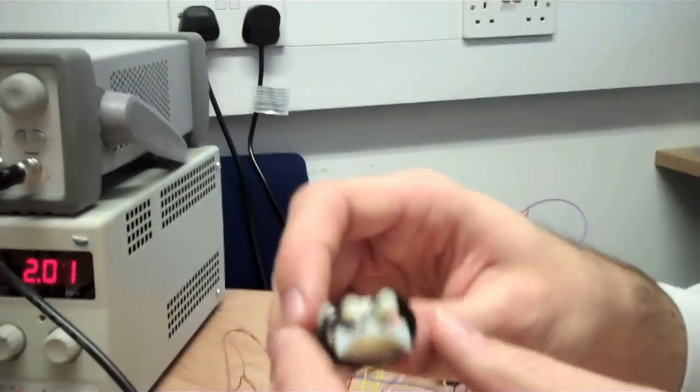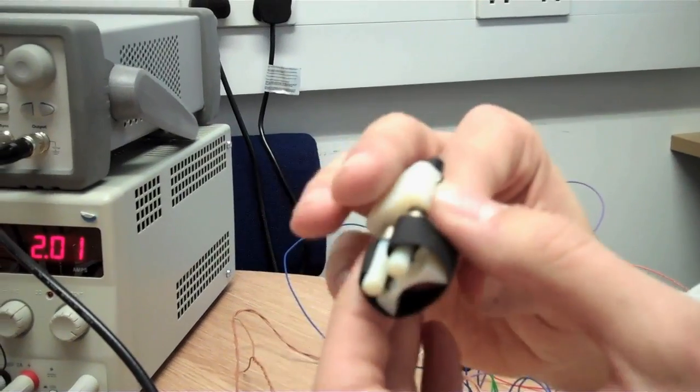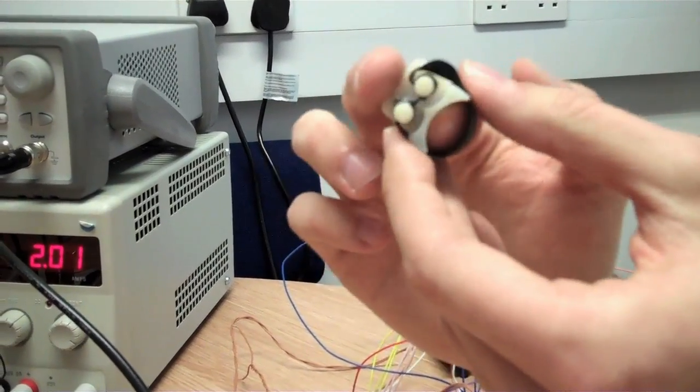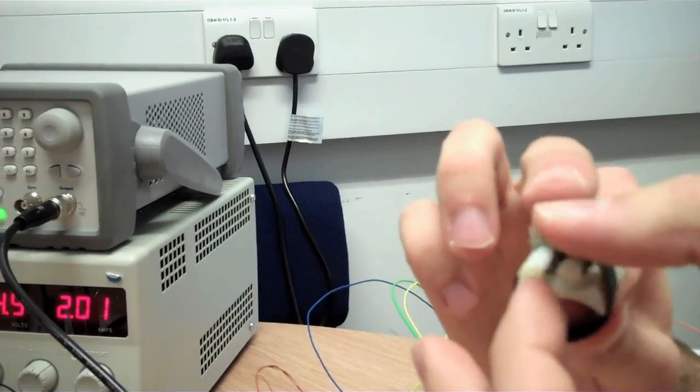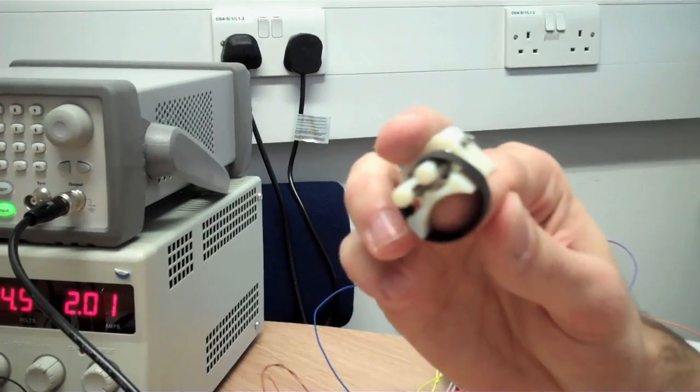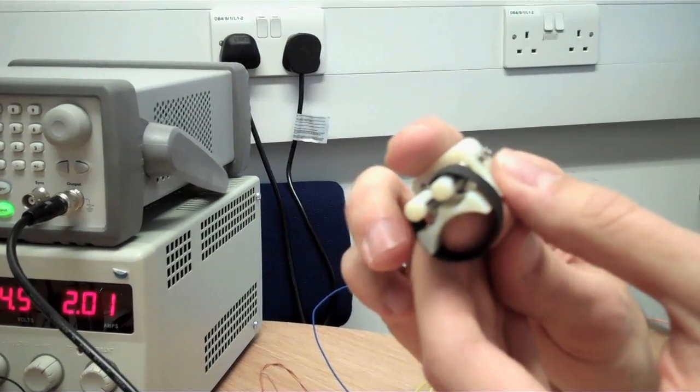The next device was based on one reported from Japan. This works by pulling a band around the fingertip. You can see that when these motors turn, that band pulls up and applies pressure to the finger. We developed this again through these stages of feedback.